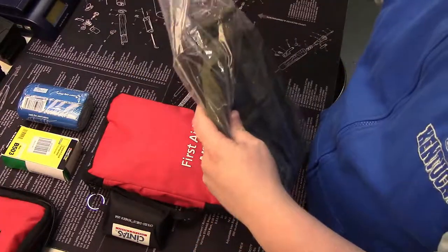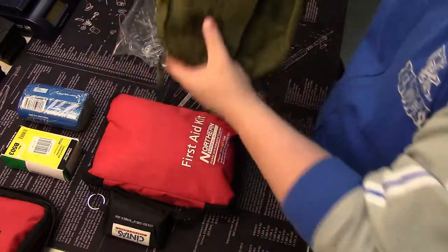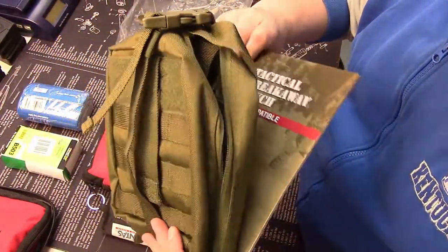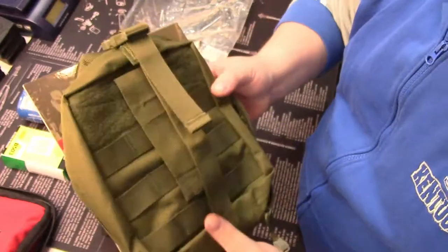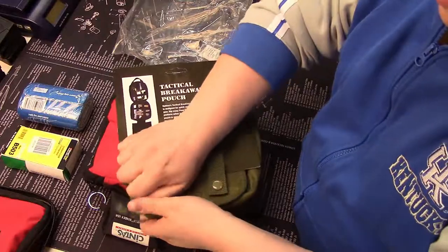So I went out and got a Rothco Tactical Breakaway pouch. This guy is MOLLE compatible and it looks to be a little bit more user friendly. I'm going to open it up here and show you what it looks like.